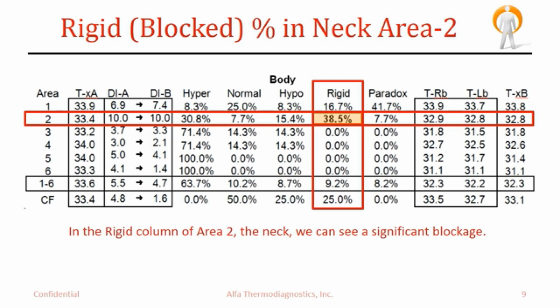We have these other cooling down, which is a toxic sign. We have the blocked sign. Here we have the thyroid, that's a little bit paradox, but then we have the thymus block. So really, there's a lymph block as what you should carry into when you look at the rest of the thermogram.